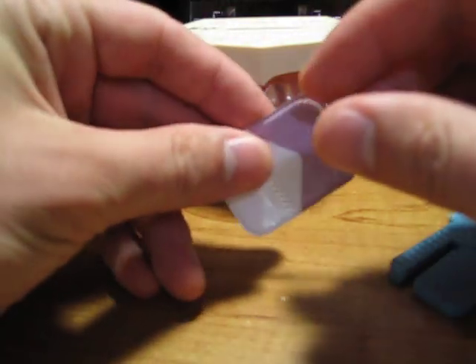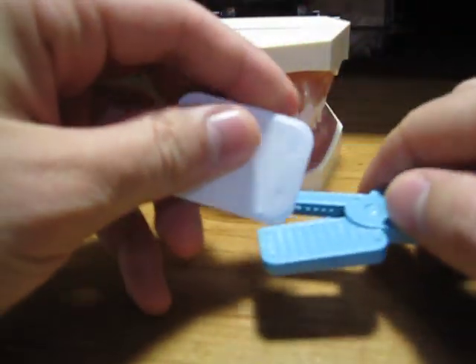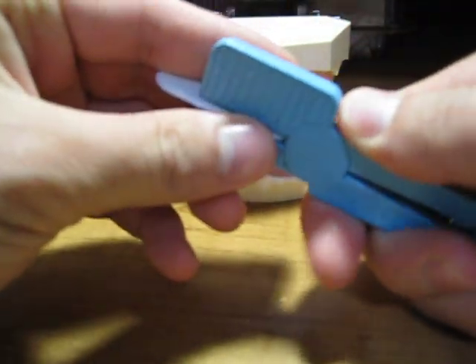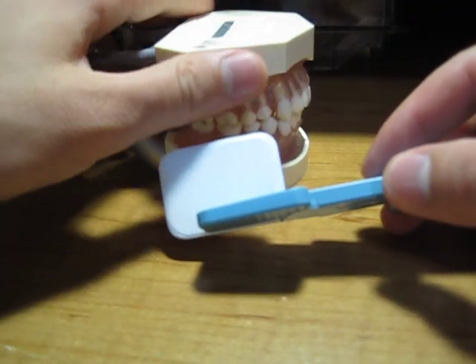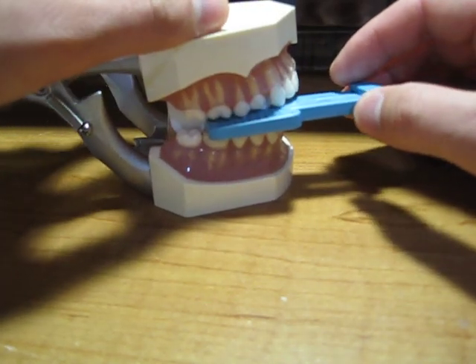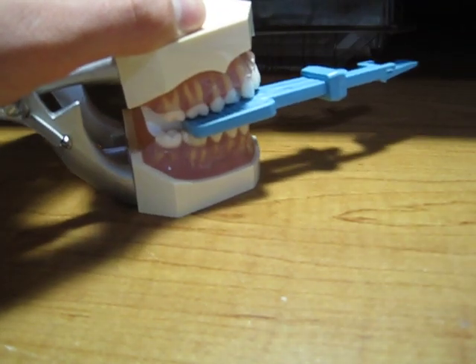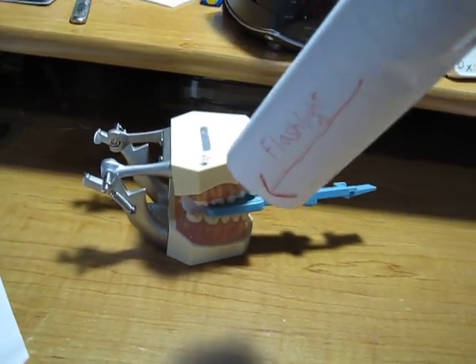To use a snap array, we'll take the film. There's a dot right here — we'll put the dot in the slot. Put it right up to the edge of the snap array. Slide this in. And then we'll put it into the patient's mouth. They will close down like this, and then you will now be ready to take the x-ray.